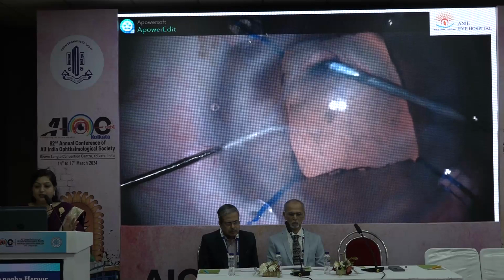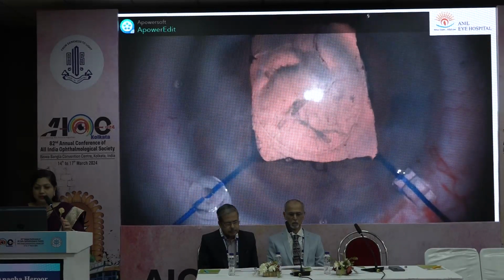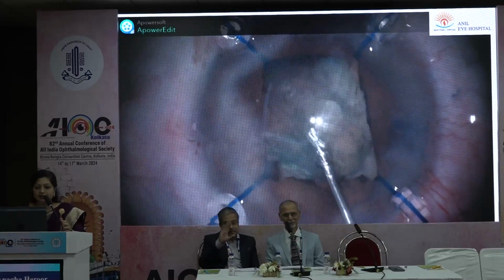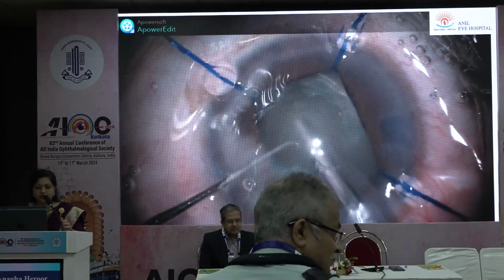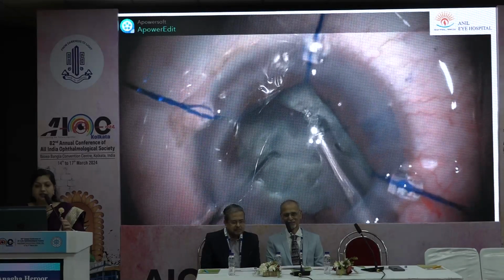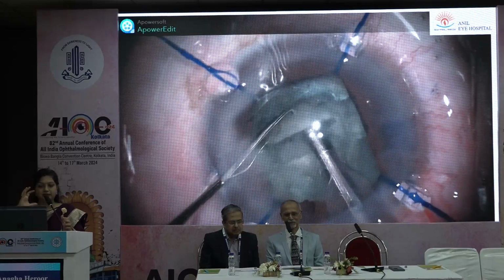And now you have an adequately sized opening where you can go in and do a capsular rhexis, and you can go in till whatever visible area is there, sometimes even slightly underneath it. A very gentle hydrodissection and hydrodelineation, and then you can move on to your choice of phacoemulsification, whether it's a stop and chop or a direct chop, and you need to be in the central safe zone.